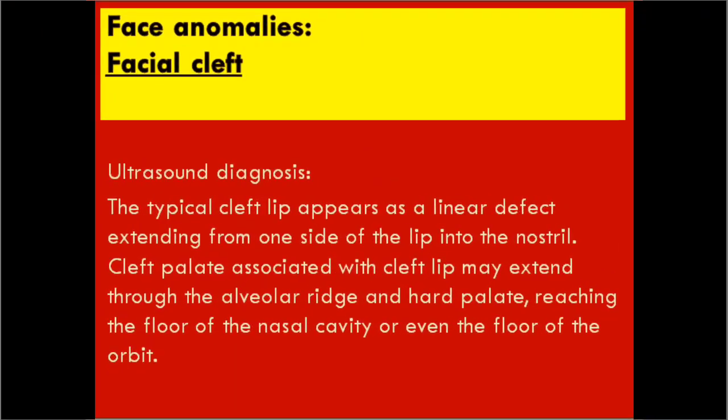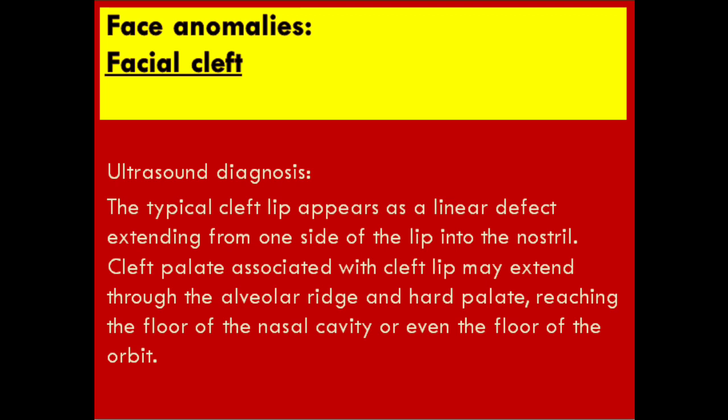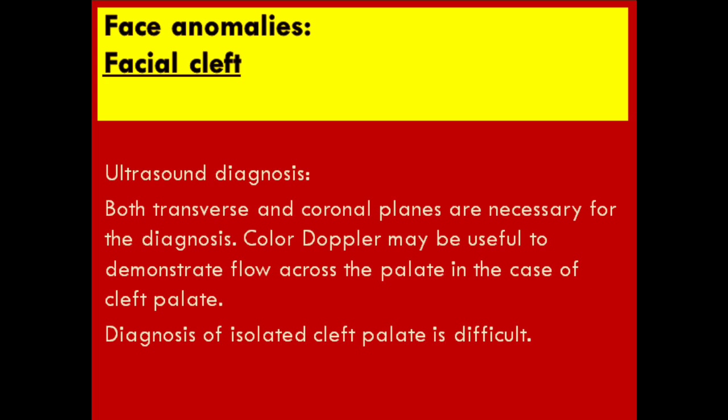The next is facial cleft. Ultrasound diagnosis: the typical cleft lip appears as a linear defect extending from one side of the lip into the nostril. Cleft palate associated with cleft lip may extend through the alveolar ridge and the hard palate, reaching the floor of the nasal cavity or even the floor of the orbit. Both transverse and coronal planes are necessary for the diagnosis. Color Doppler may be useful to demonstrate flow across the palate in the case of cleft palate. Diagnosis of isolated cleft palate is difficult.